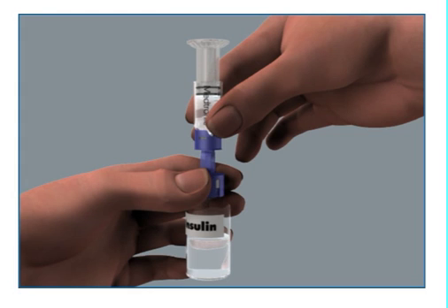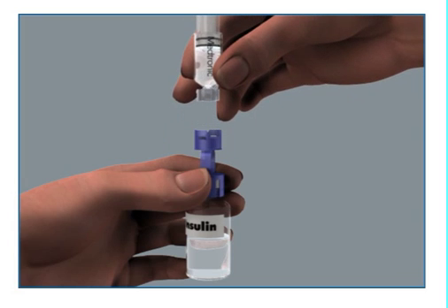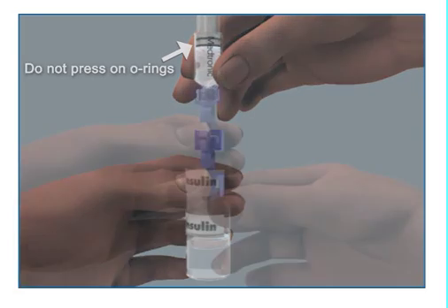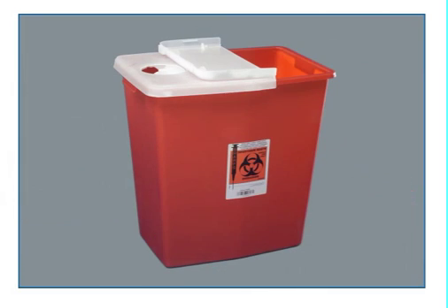To avoid getting liquid on top of the reservoir, flip the reservoir over so the reservoir is on top. With the vial down on the table, hold the transfer guard with one hand. With your other hand, turn the reservoir counter-clockwise, then pull straight up to remove it from the transfer guard. Be careful not to press on the o-rings. Disconnect the transfer guard from the vial and dispose of it properly.